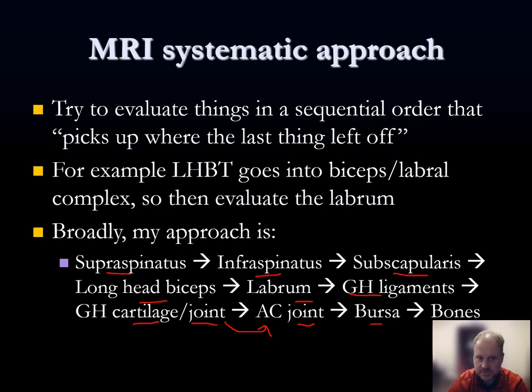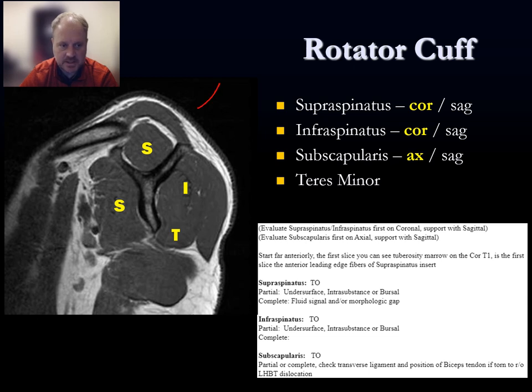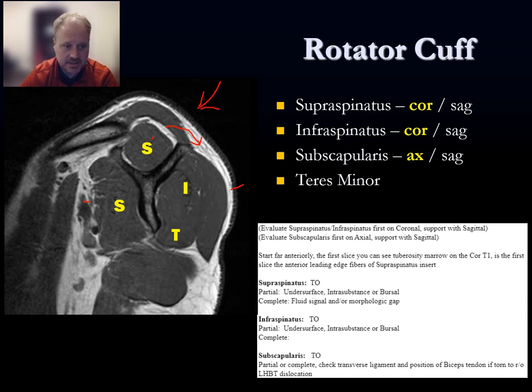The rotator cuff is one of the bigger topics, especially important in older patients where orthopedists want to know if there's a tear. A useful way to learn the anatomy is on the sagittal image, going around the clock using the mnemonic SITS: Supraspinatus, Infraspinatus, Teres minor, and Subscapularis — remembering that subscapularis is the more anterior structure and infraspinatus/teres minor are more posterior. We'll start looking at supraspinatus on the coronal sequence at its most anterior insertional fibers.